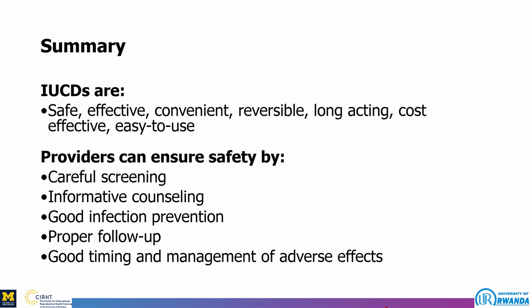In summary, based on what we have discussed from the introduction and from what you have seen in the video, we have seen that intrauterine contraceptive devices are safe, effective, convenient, reversible, long-acting, cost-effective and easy to use. Providers can ensure safety by careful screening, informative counseling, good infection prevention technique during the insertion process, proper follow-up of the client, good timing for insertion, and management of adverse events.